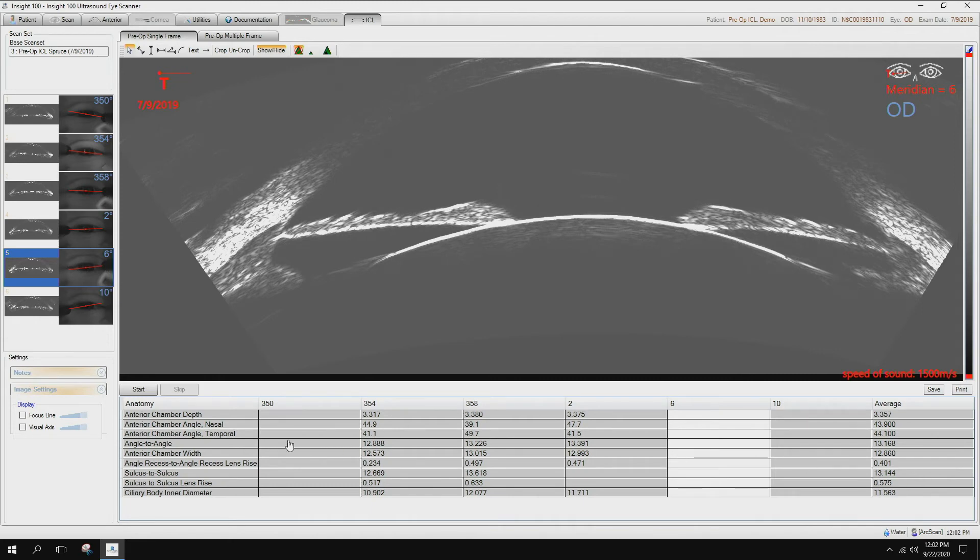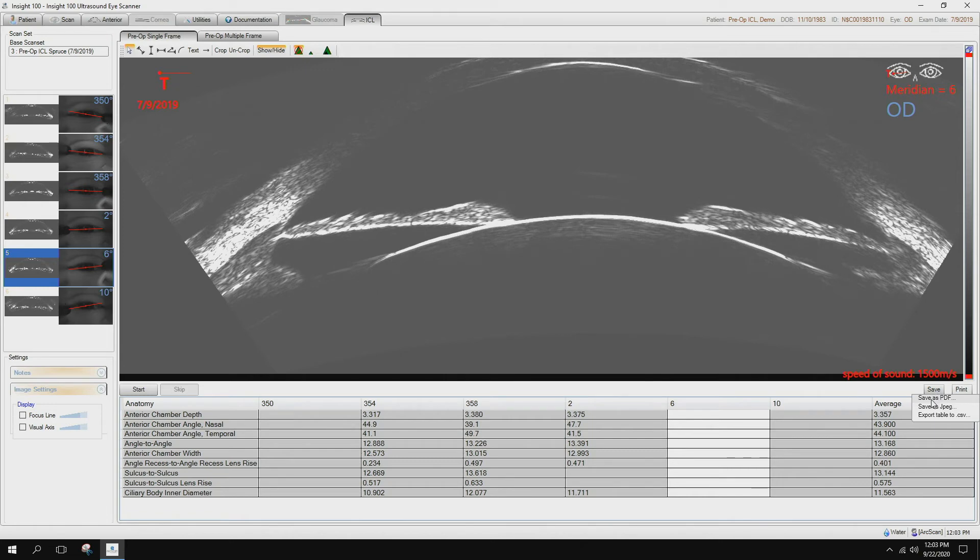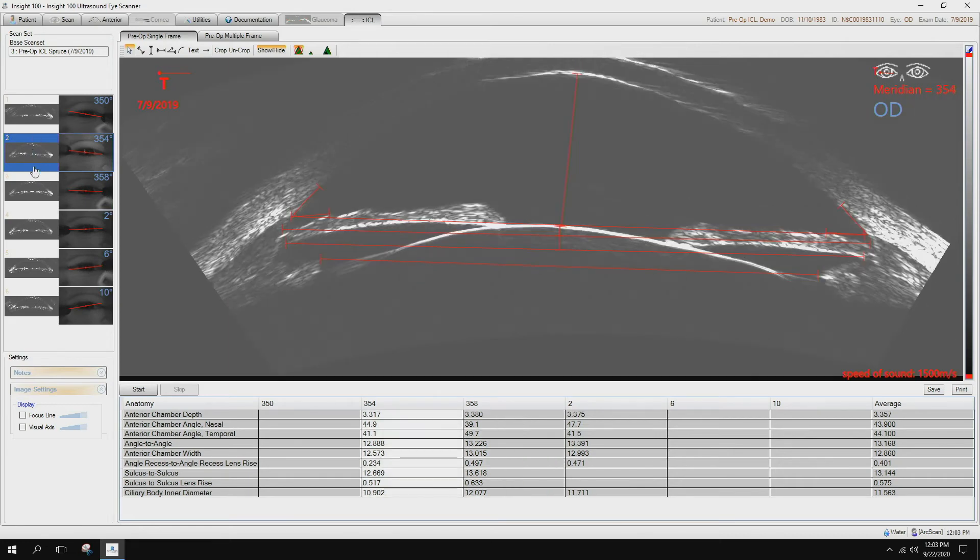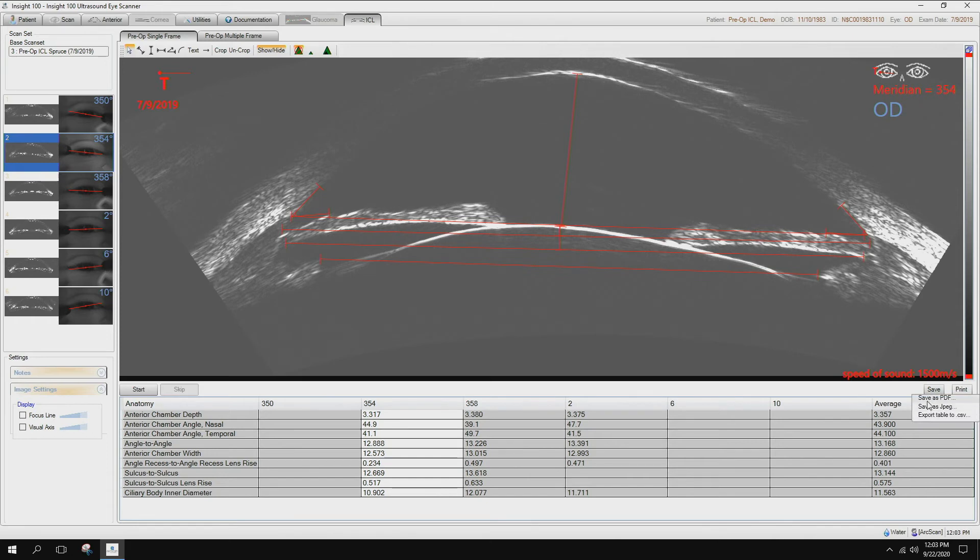Once you have gone through those and you feel that you have enough of your measurements taken, right here is the save button. Clicking on the save button, you have a couple options. You can save this image set as a PDF. Prior to saving it as a PDF, make sure you choose which one of these you feel is the best image to be present on that PDF. So when I hit save and save as a PDF, it is going to save that on this computer as a report with that picture and with all of the measurements that you have down on the table below.